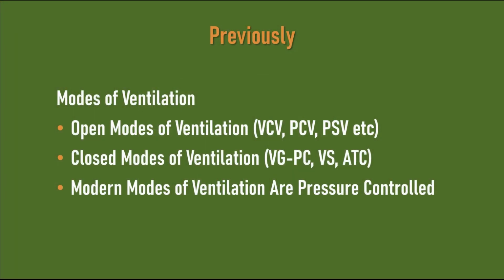In my previous tutorials, I looked at all kinds of different modes of ventilation, and these can be neatly characterized as open modes, where the operator has most of the control over how the patient interacts with the ventilator. These include what you might call standard modes: volume and pressure control that may be assist controlled or SIMV, pressure support, and bilevel. A more modern approach is to close the loop.